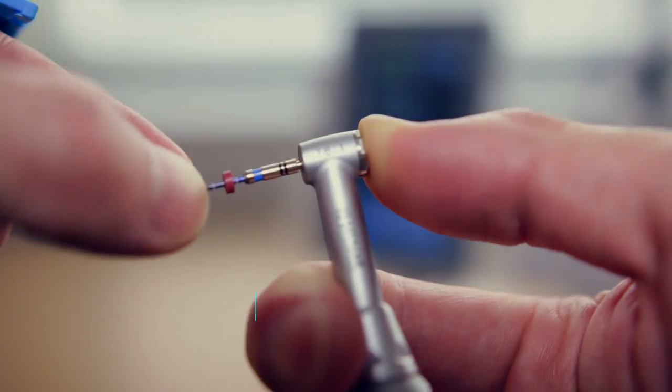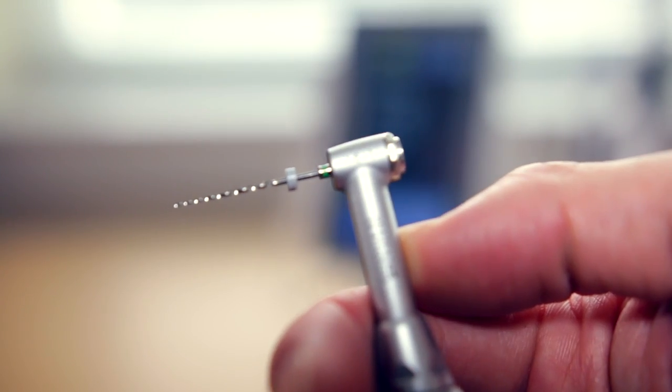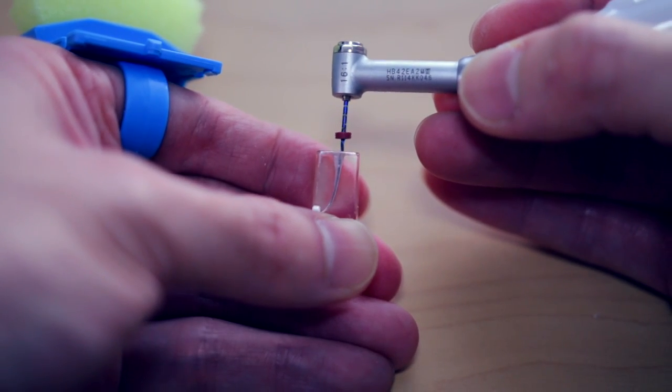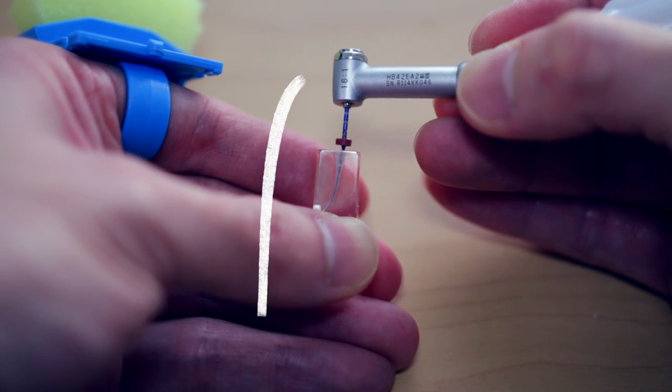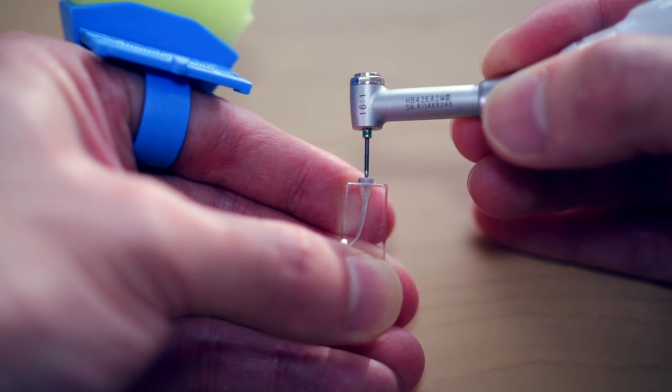After removing the coronal and mid-section of the canals, I move forward to a constant taper file. I use either a Vortex Blue or an EndoSequence file — I included both just to demonstrate the two possibilities, but in general I just pick one. I move from F1 to a 30/04 Vortex Blue file, using in-and-out pecking motions down to the apex. Then I irrigate again. With the EndoSequence 35/04 file, the technique is different — I go in one swoop with mild pressure and come out immediately after the apex. It cuts very aggressively, so you just let the file spin and don't stay in too long.